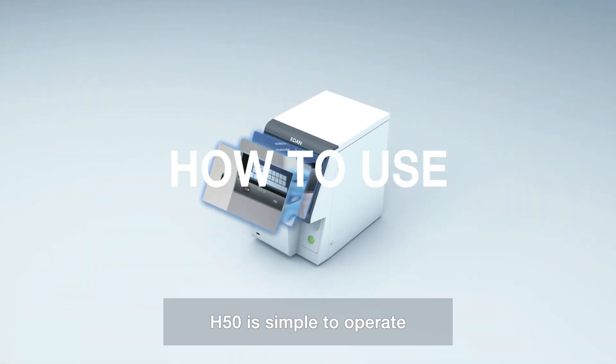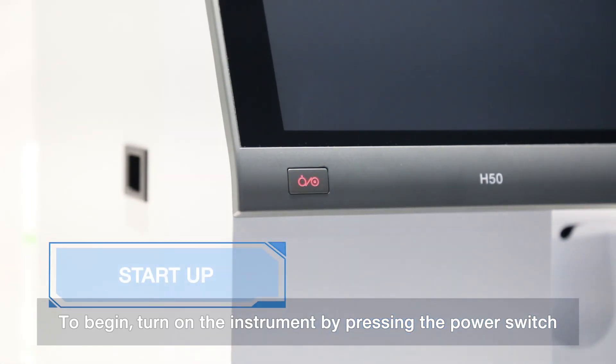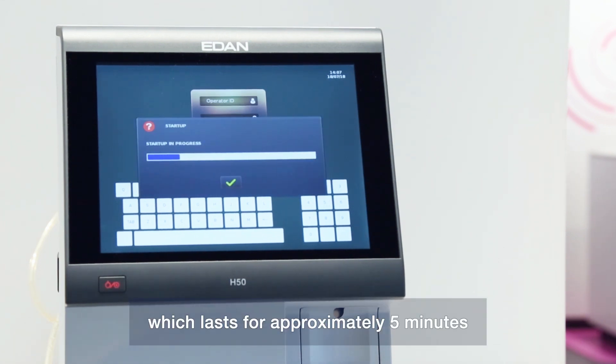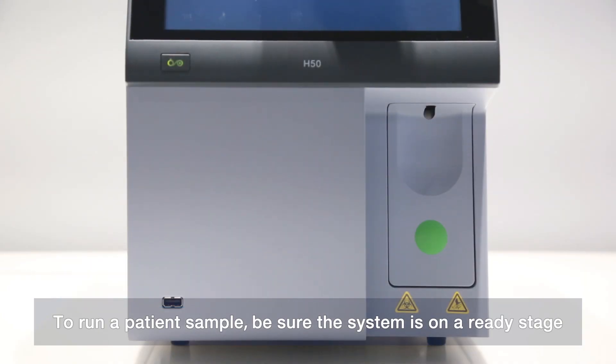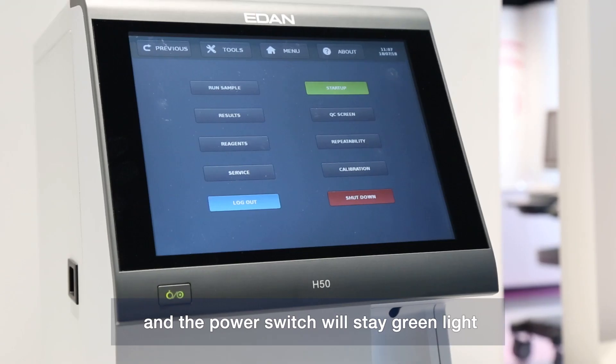H50 is simple to operate. To begin, turn on the instrument by pressing the power switch. The unit is prompted to run a self-test, which lasts approximately 5 minutes, and the analyzer background check is also performed. To run a patient sample, ensure the system is in a ready state — the needle will come out and the power switch will stay green.